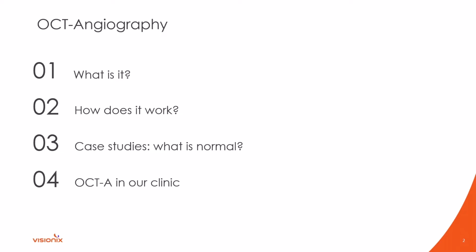We're going to go through: what is OCTA? How does it work? What is normal? You really can't know what abnormal is until you know what normal is. So you've got to be comfortable going, okay, this is what it should look like, and now this is what it's looking like in our patient. It doesn't look normal. Well, what's going on? What is it in this particular case?